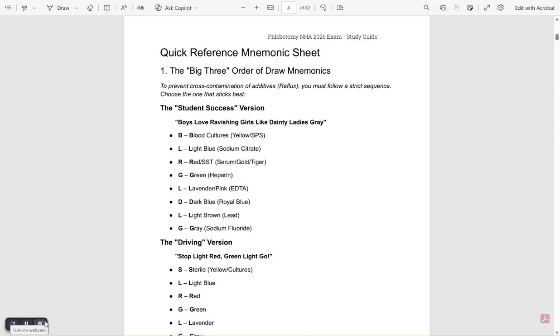Hello friends, today we are going to do some quick references on the Phlebotomy NHA 2026 exam. This is a walkthrough of our cheat sheet, and let's go through this. First, let's learn about the big three: order of draw.